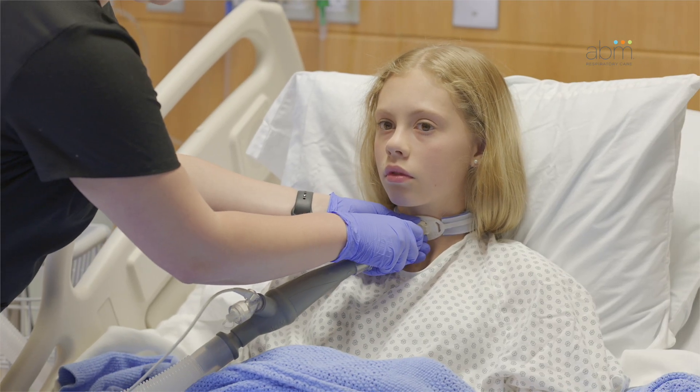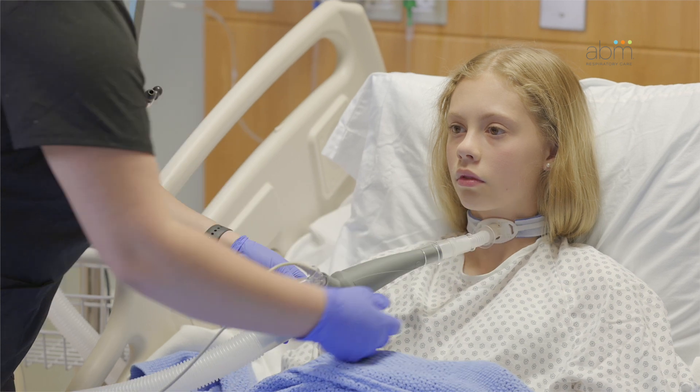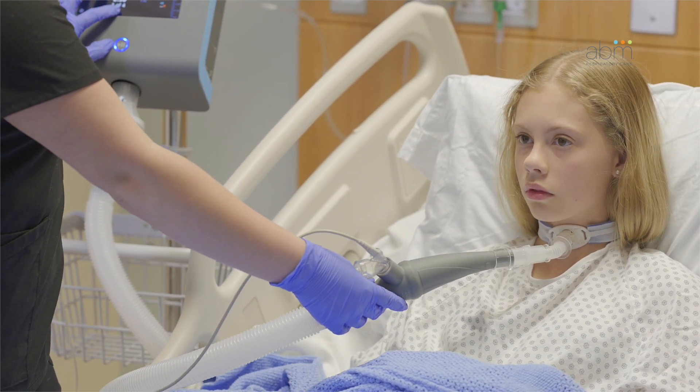If the patient has a tracheostomy, hold the handset during therapy so there isn't additional pressure on the patient's tracheostomy.